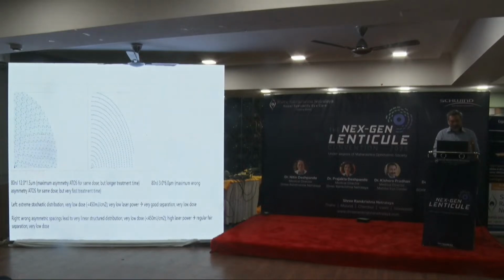And then again, 80, 12 point, a big asymmetry is also dangerous. Otherwise, sometimes your treatment can go on for 2 minutes. If you have a 12 micron interspot and a 1 micron track distance, the track has to go on and on and on. Okay? So the time can be very long.